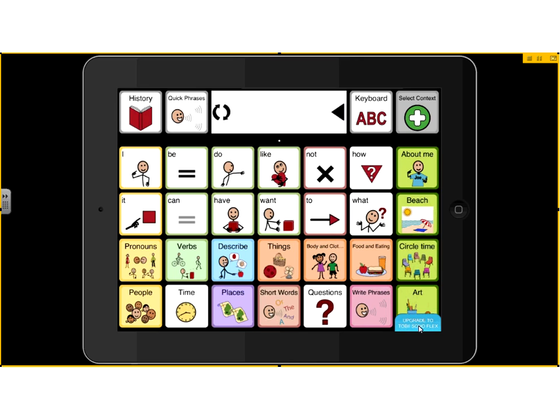Also, right now in the free version, you're only able to use 12 of the 50 predefined contexts. You only have access to 3,250 of the 11,000 symbols that are available. And you only have room in this to create 3 new contexts. So if you want access to more of their pre-made contexts, more of their symbols, and you want to be able to create more contexts, and you want to speak without having it say anything about a free trial or having to reset, then you'd want to spend the $100 to buy it. But for demo purposes, I think Sonoflex Lite is great.